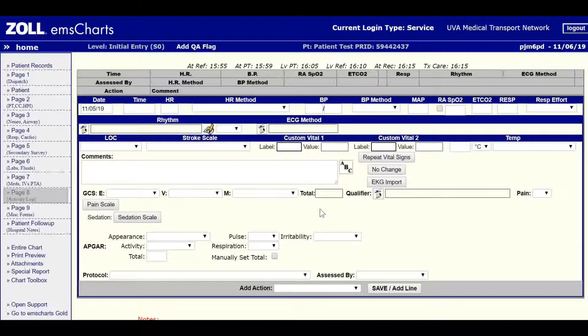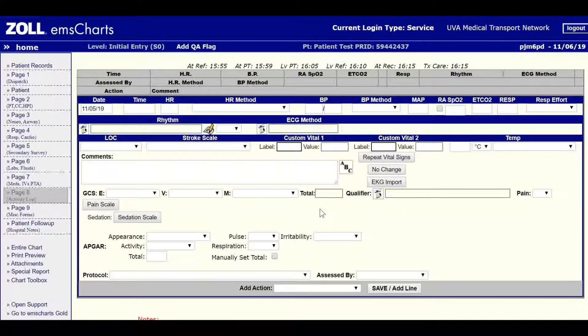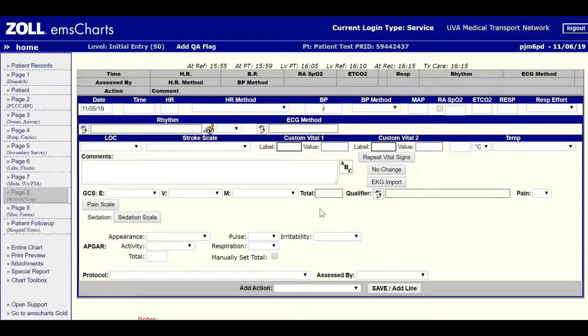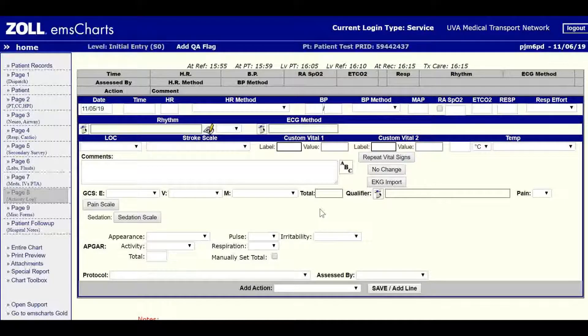Hello everybody and welcome back to tying it all together with EMS Charts and the Zoll Monitor. We're going to jump right into it.